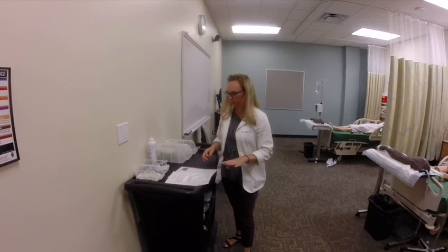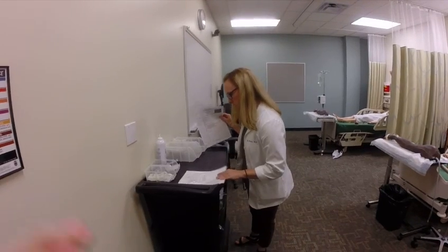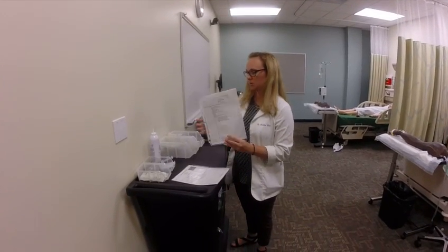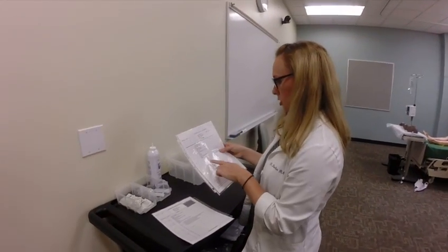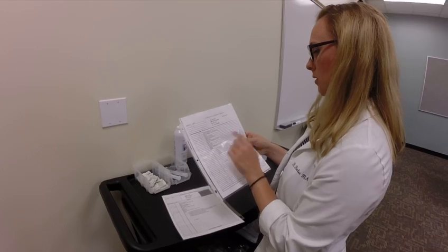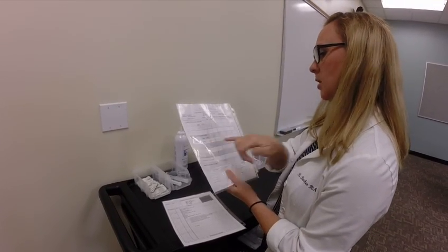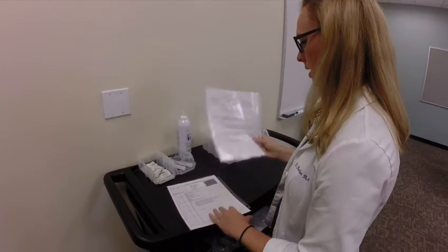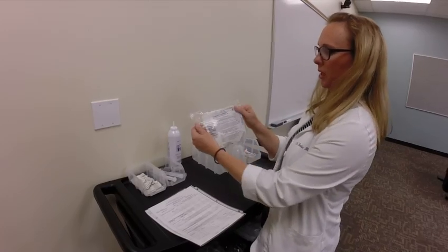And that is going to be Mr. Kurt Smith. So Mr. Smith is patient A. I want to verify all of my information, and then I'm giving NS 1 liter over 8 hours, and that matches my MAR. So my NS 1 liter, 125 mils per hour. So what I need for my primary is my Plum Set, because I'm using the Plum Pump.